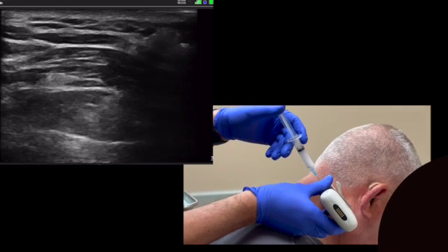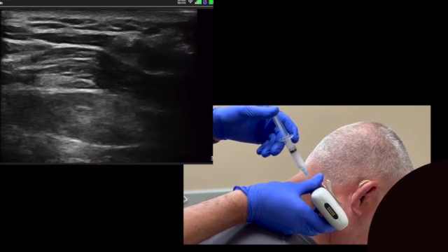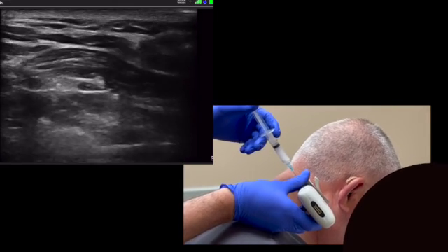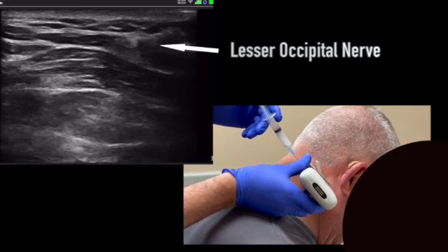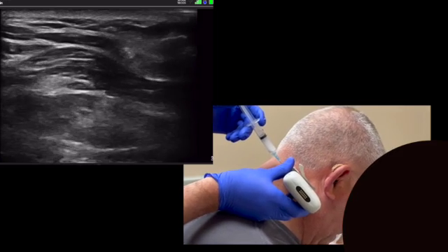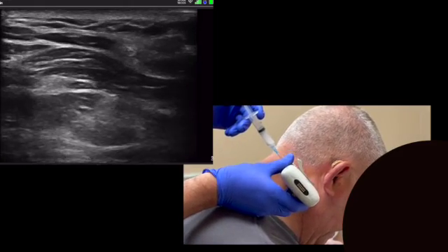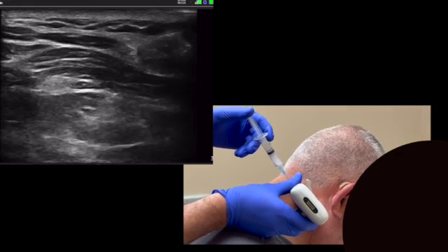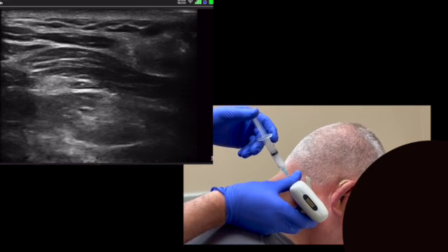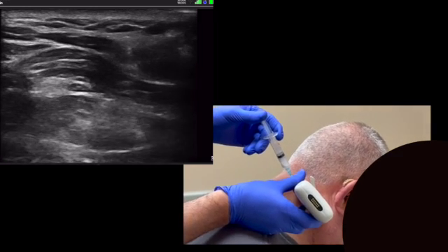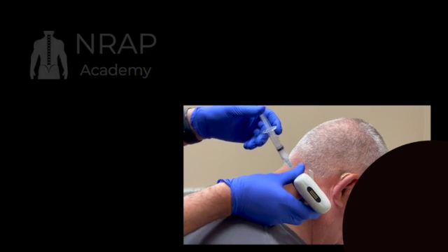Here we demonstrate a patient who has had chronic headaches and multiple occipital nerve blocks. He had a prior cryoablation of the occipital nerve and still experienced headaches in the supraorbital and lesser occipital regions. A supraorbital nerve block alleviated his frontal headaches, but he continued to suffer from pain behind his ear in the distribution of the lesser occipital nerve. Today he is undergoing a lesser occipital nerve block, which relieved his pain as well as the pain below the nerve in the mid-neck on the day of service.